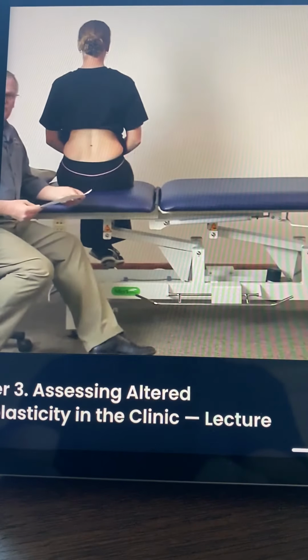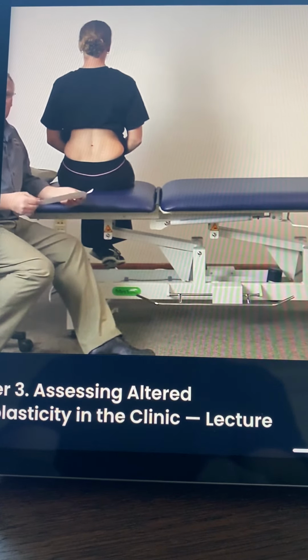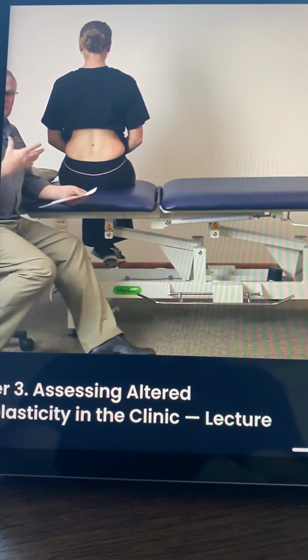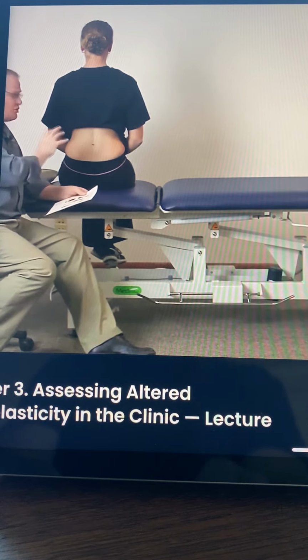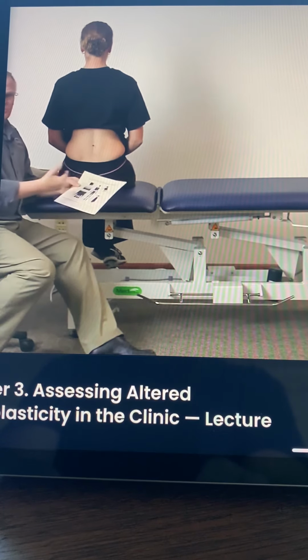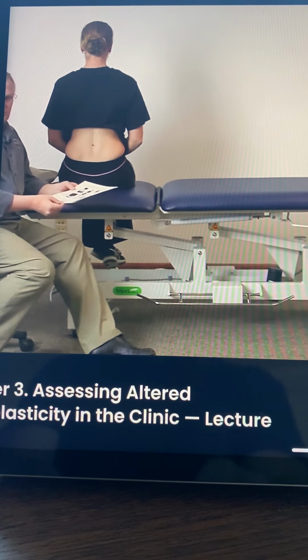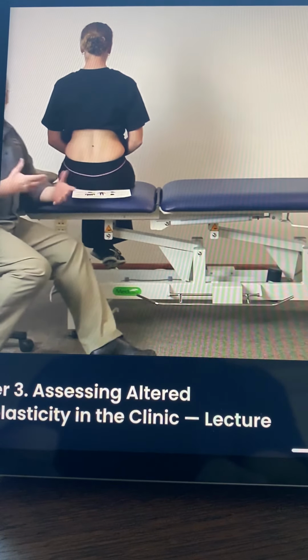In this session, we're going to talk a little bit about 2-point discrimination. We have mentioned that 2-point discrimination can be the best way for a clinician to figure out issues with brain plasticity. In a real clinic, we don't have functional MRIs, but 2-point discrimination can give us a snapshot of what occurs in the brain related to body parts. The 2-point discrimination norms are set. We often use the information from Catley's study, which you will also find on the information site on our website. We're going to do 2-point discrimination in this case for a patient with low back pain.